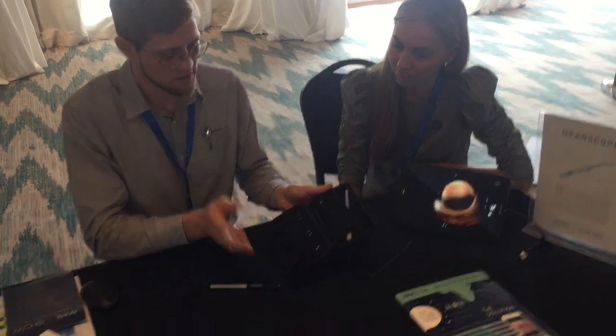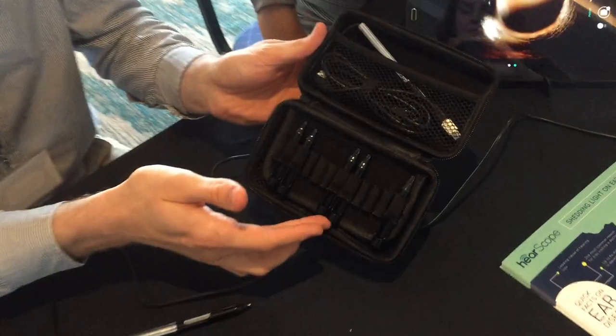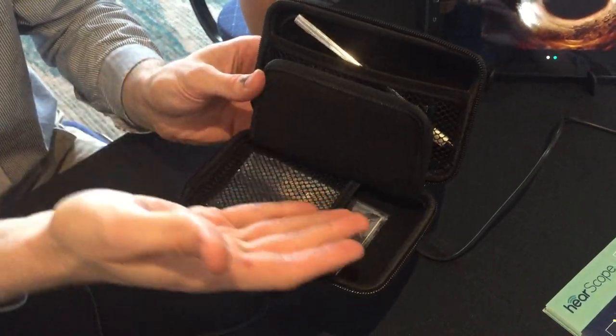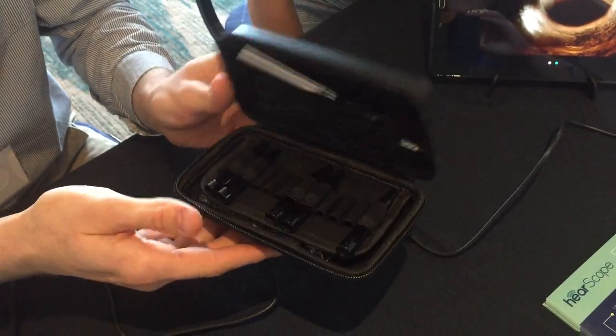It comes in a little pouch like this. It's got the device, different ear tips — three different sizes to fit different ears — a manual, and a nifty little stand.